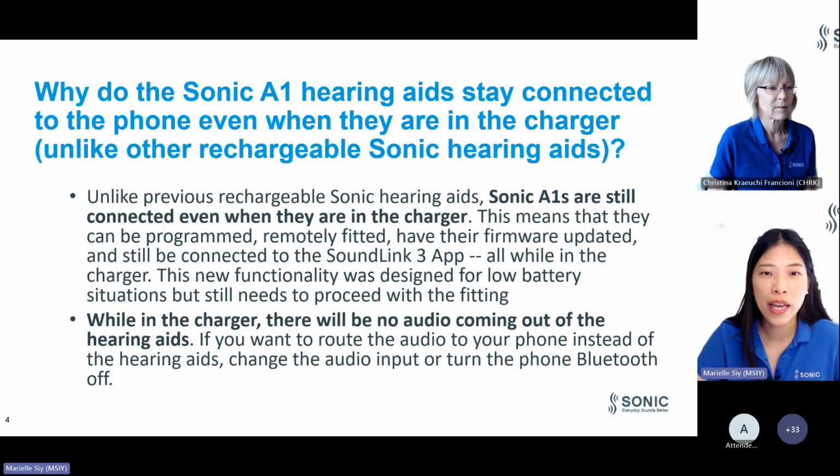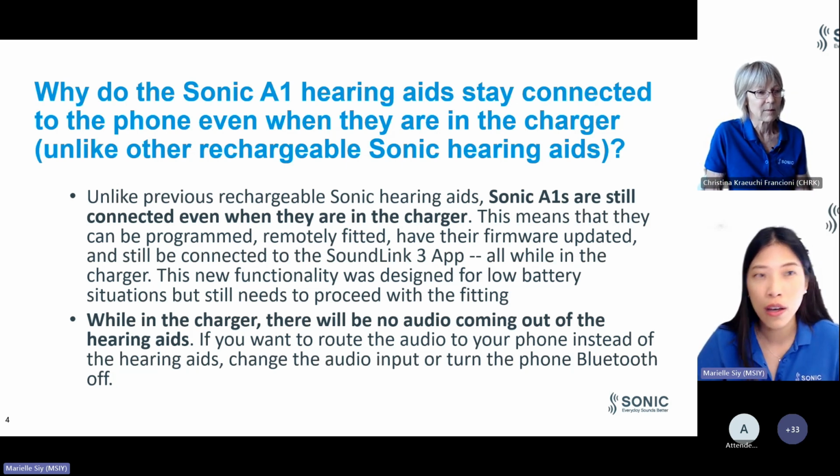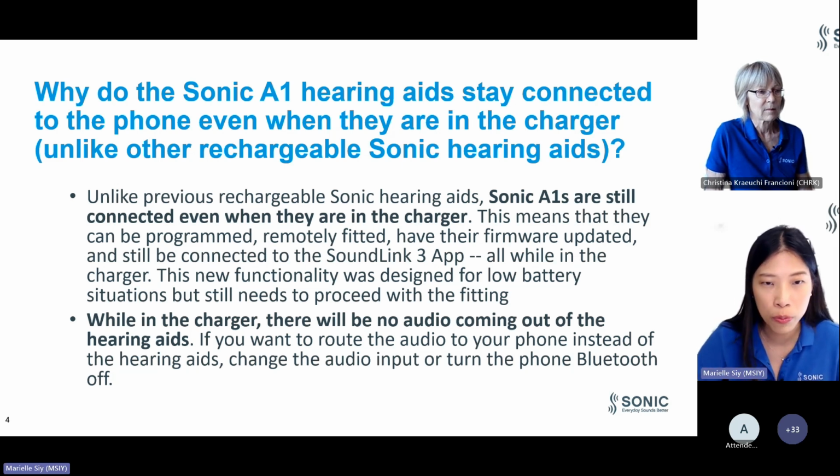Why do the Sonic A1 hearing aids stay connected to the phone even when they are in the charger? The other rechargeable Sonic hearing aids like Radiant SE don't behave the same as the Sonic A1 rechargeable. Unlike the previous rechargeable hearing aids, Sonic A1s are actually still connected even when they are in the charger.